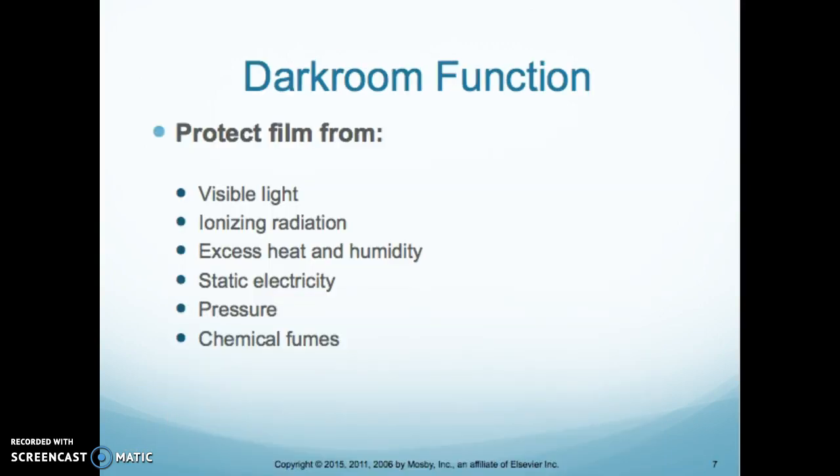So the darkroom is to protect the film from visible light, any kind of ionizing radiation, excessive heat and humidity, and static electricity. You want to keep the film from getting pressure marks, and you want to ventilate so that the chemicals don't build up on the film.